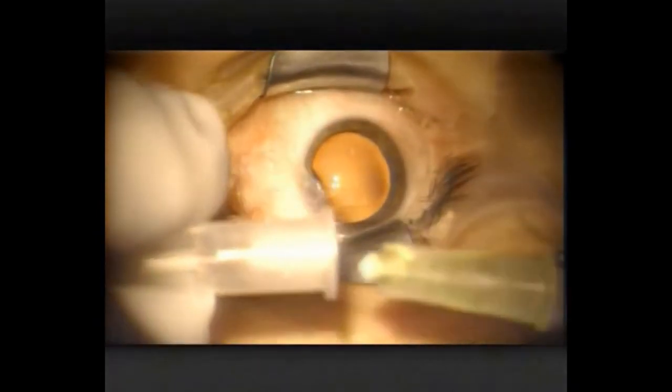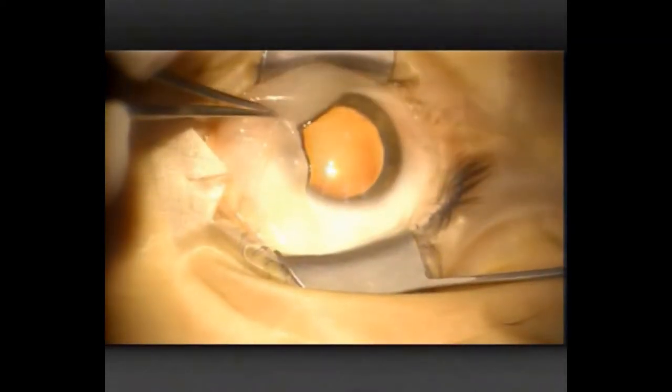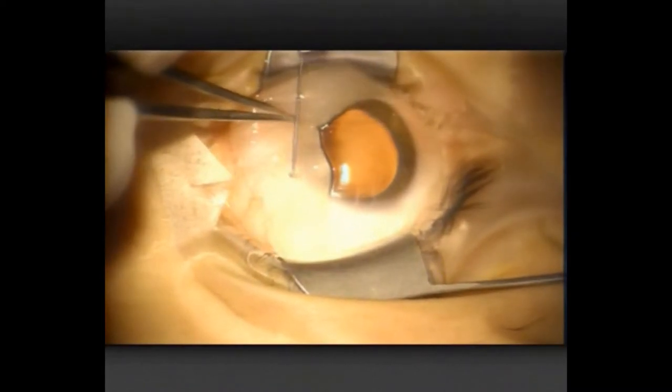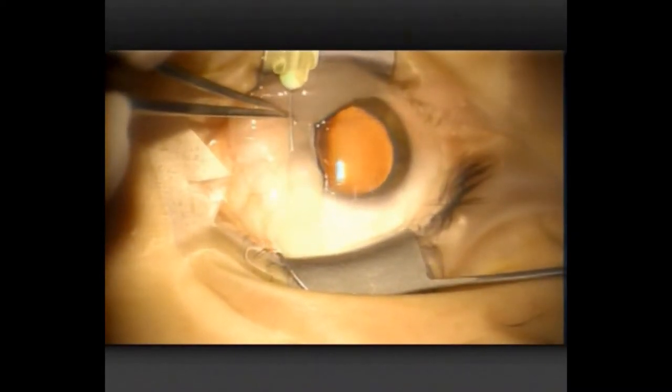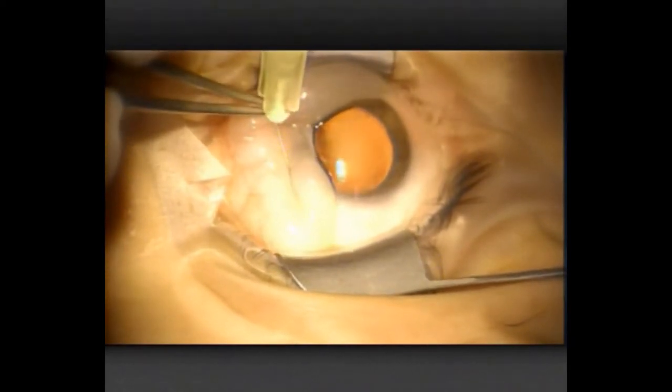Just bending the 30-gauge needle here to inject some local anaesthetic. She's under sedation, so I'm not feeling too much of that. We use the local to obviously anaesthetise the eye, but also to balloon up the conjunctiva, which helps with dissection. Now I'm injecting superiorly in preparation for harvesting a graft.